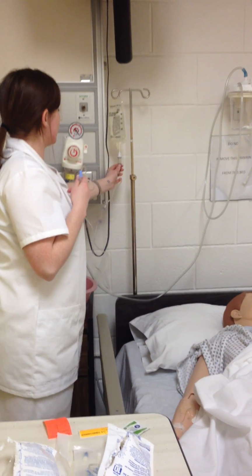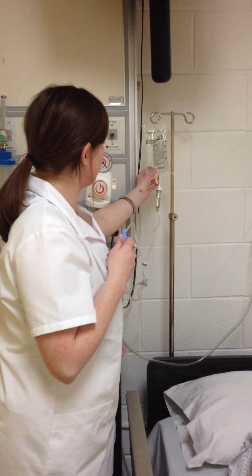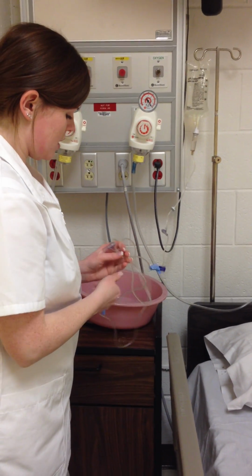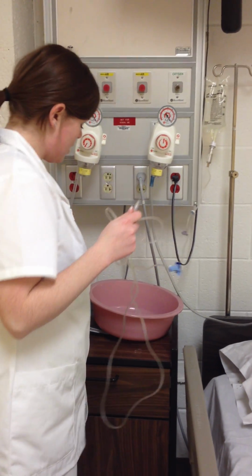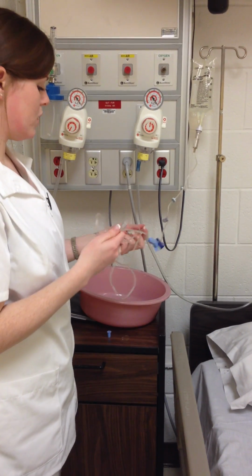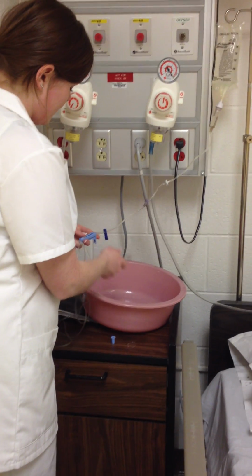I'm going to fill my drop chamber. I'm going to remove the cap to the tubing. I'm going to keep it upward so it stays sterile. I'm going to keep the tubing above my waist. I'm going to open the clamp and prime the line.